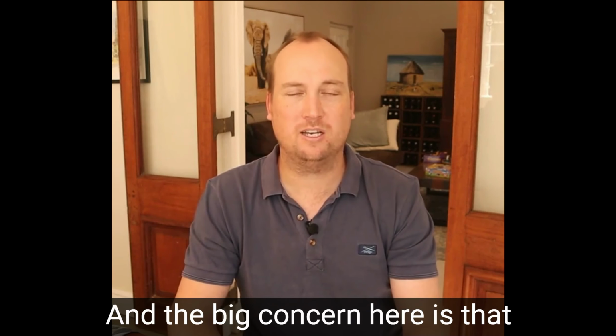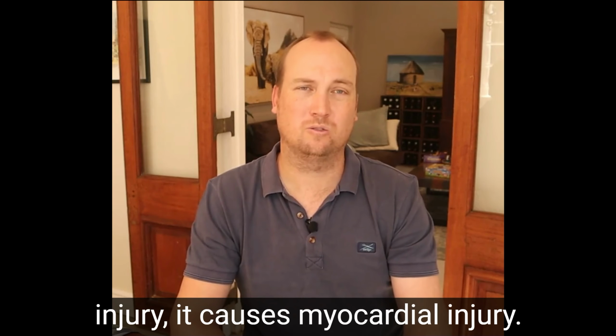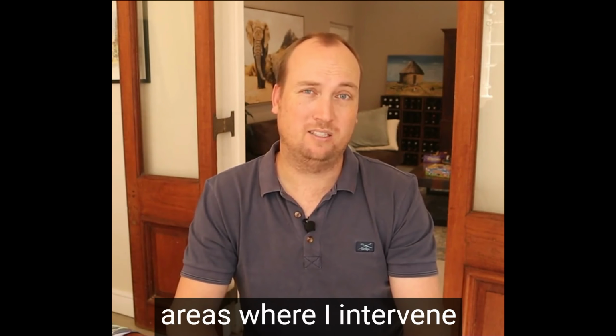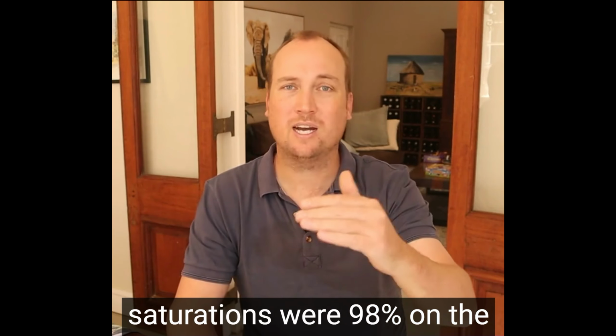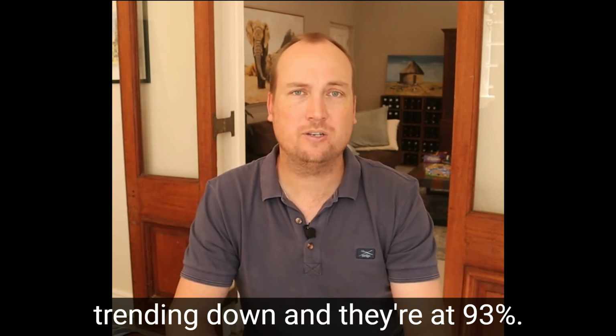And the big concern here is that hypotension causes acute kidney injury, it causes myocardial injury, and so I intervene early. And then one of the other areas where I intervene early is when the oxygen saturations are trending down. So we started a case and the saturations were 98% on the ventilator, and now they're trending down and they're at 93%.